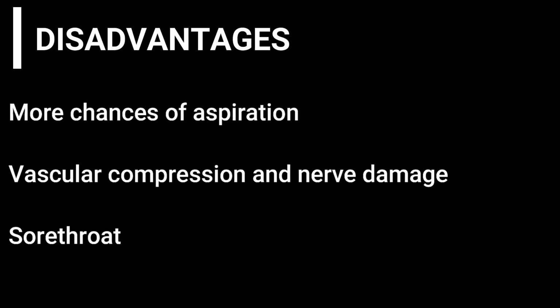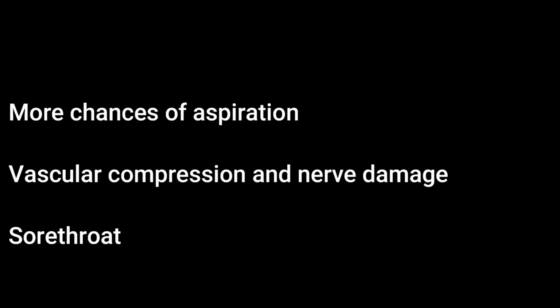Disadvantages. There are more chances of aspiration, vascular compression and nerve damage, and sore throat. The most commonly used supraglottic devices are the CLMA, the classical LMA, the PLMA, the ProSeal LMA, the iGel, and the ILMA, or intubating LMA.